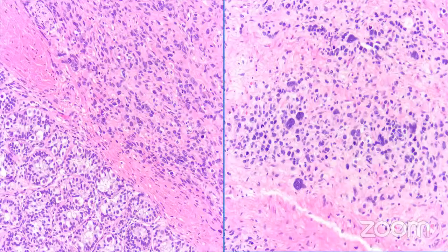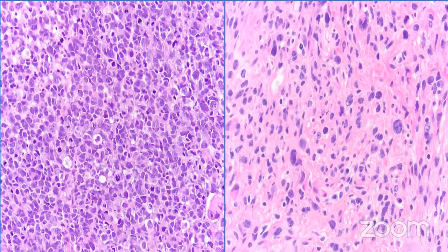This is an example of a paratesticular tumor, as evident by the tubules on this side, which shows focal anaplasia characterized by just large, very hyperchromatic cells. As discussed, it could be focal or it could be diffuse in different tumors.